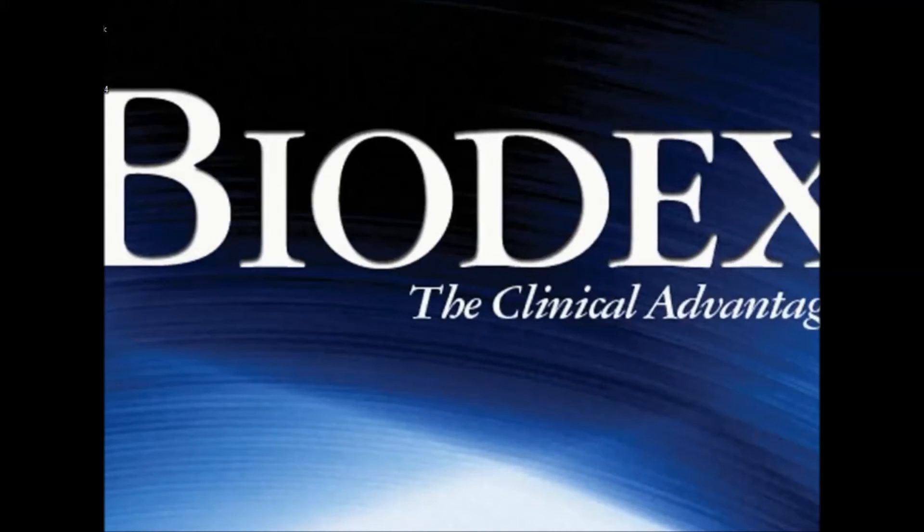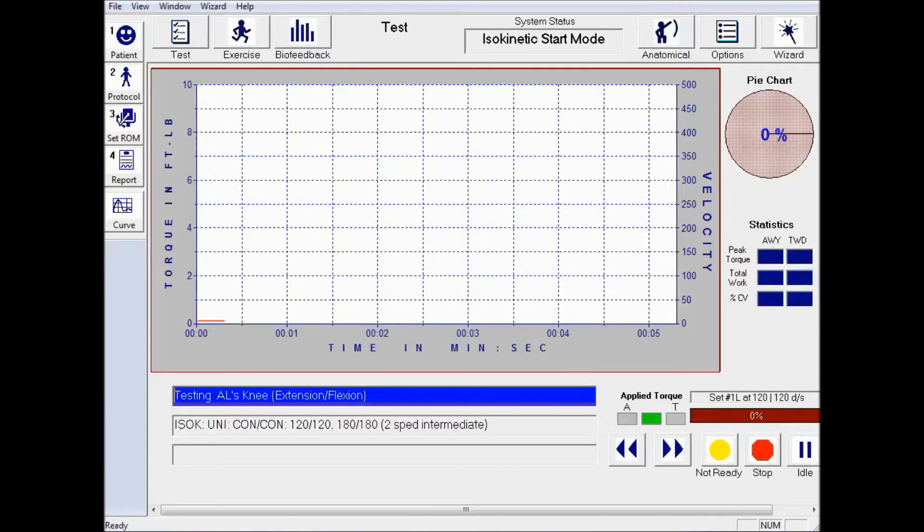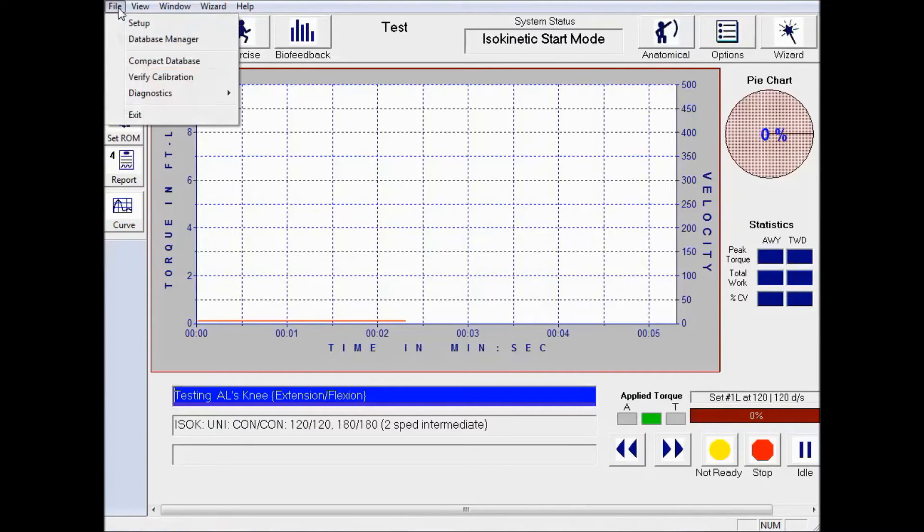On the software, we're going to be clicking on File, Verify Calibration.